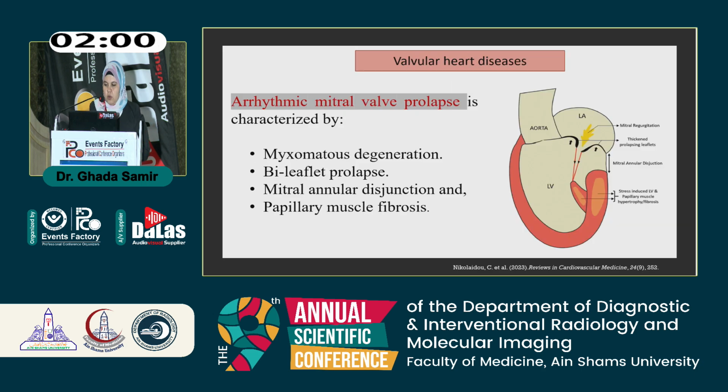Regarding valvular heart disease, the CMR can also help in the diagnosis of valvular disease that leads to arrhythmia, for example, arrhythmic mitral valve prolapse, which is characterized mainly by myxomatous degeneration of the valve leaflets, represented by valve thickening, bileaflet prolapse, mitral annular disjunction, and papillary muscle fibrosis.